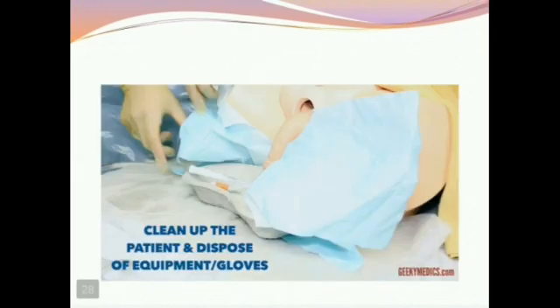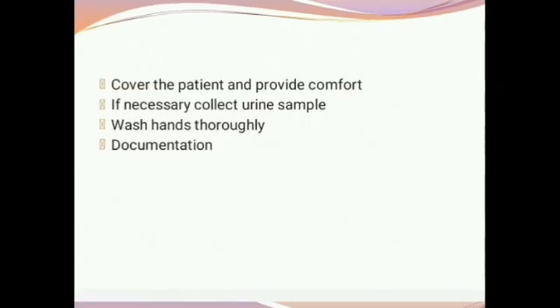Clean up the patient and dispose of equipment and gloves. Cover the patient and provide comfort. If necessary, collect urine sample. Wash hands thoroughly. Documentation.